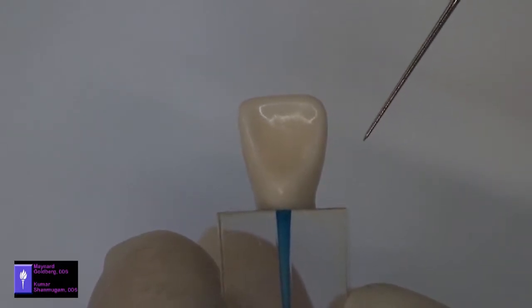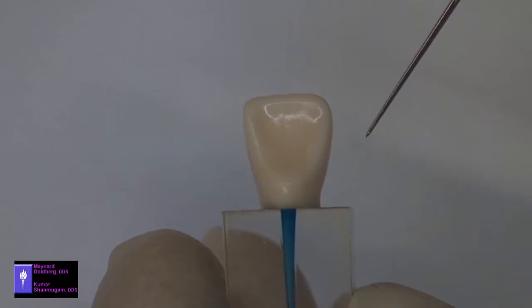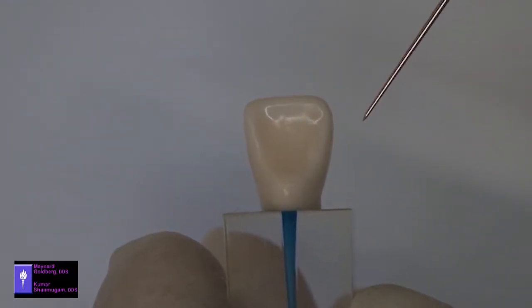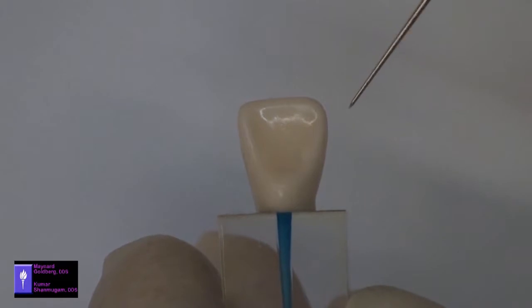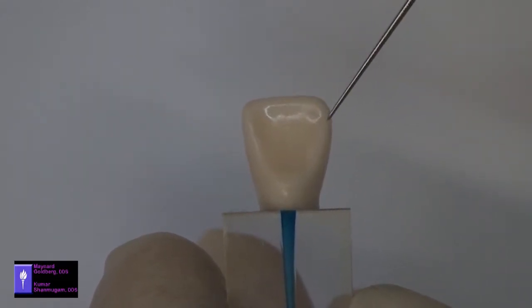The walls of every access cavity must diverge from each other at all levels of the cavity. The narrowest part of the cavity will be at the floor. The widest part of the cavity will be at the incisal end or the occlusal end of the access cavity.